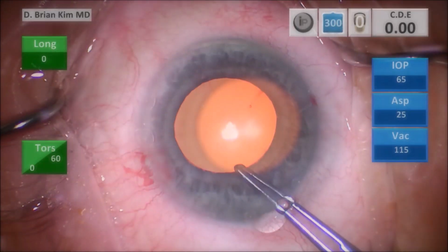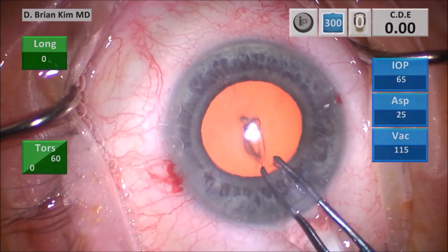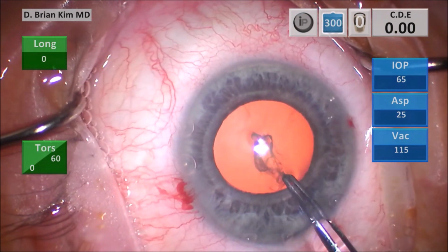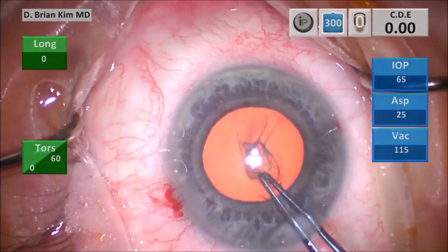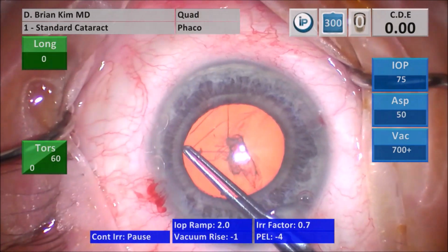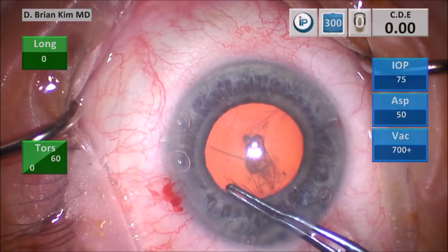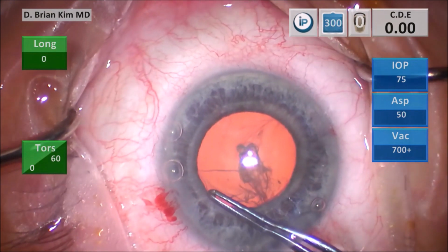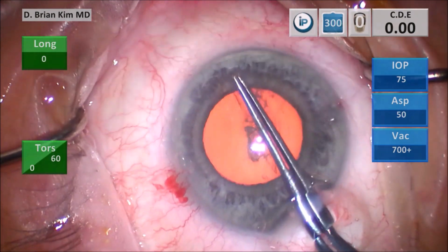I place my rhexis forceps. I do a puncture technique. I puncture with the rhexis forceps. I pull down slightly on the left side, and then I turn a little bit to the right to create a little bit of a C-shaped flap. I grab and re-grab, trying to follow my corneal marks to help me center and size the rhexis. I'm making sure I'm not burping too much viscoelastic as I go around, and I'm able to get a nice, well-centered and round capsular rhexis.